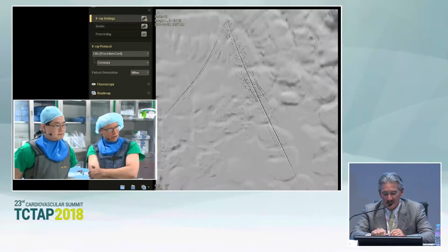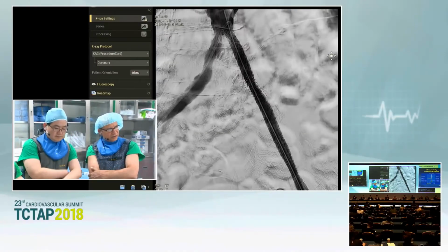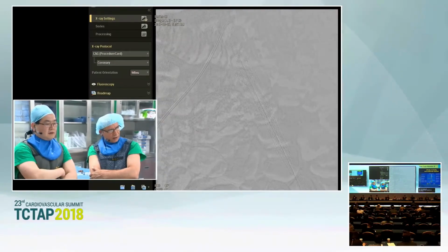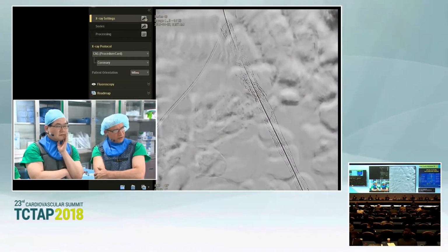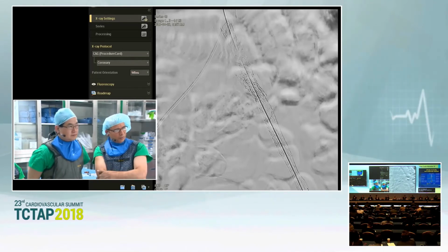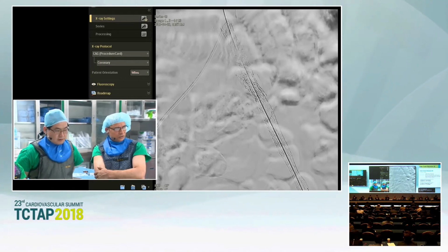We just used the normal balloon that accompanies the Life Stream stent, and initially dilated to the nominal pressure without causing harm to the external, and then we dilated to the burst pressure in the common iliac. On the views that we did, and this is only one of the views that you're seeing, we didn't think there was any significant compression to warrant any more active higher pressure balloon use. And with the normal pressure waveform and the pressure measurements on the sheath, we elected not to do the IVUS. Although it was already there, we could have used it.